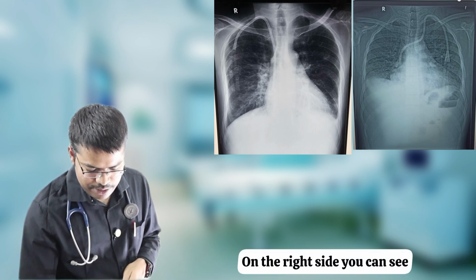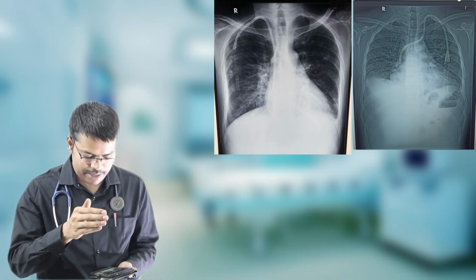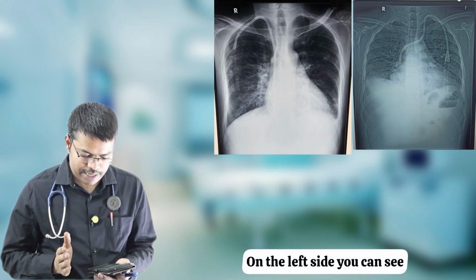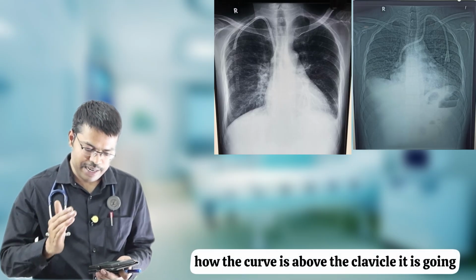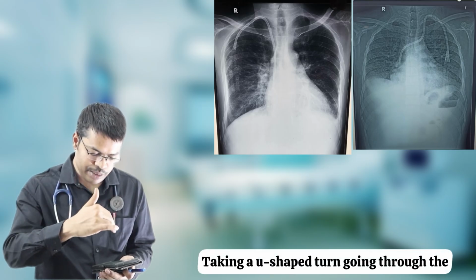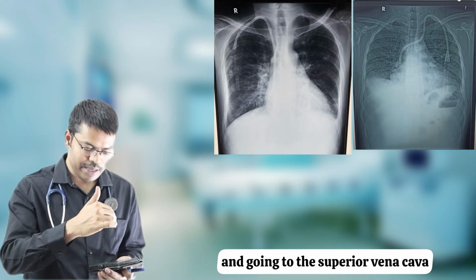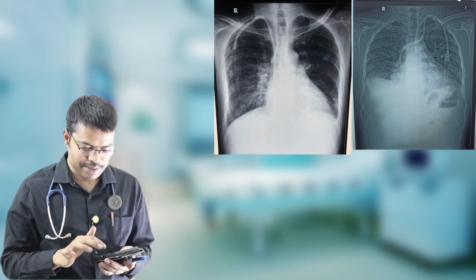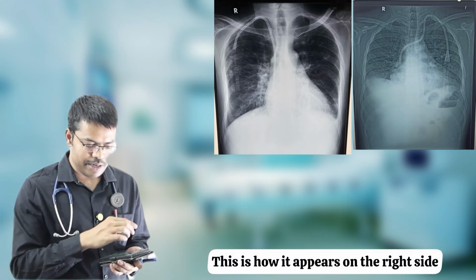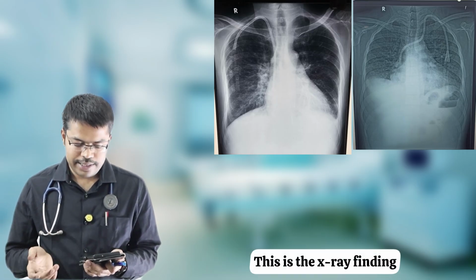On the right side, you can see the catheter is U-shaped and coming towards the right atrium. On the left side, you can see how the curve is above the clavicle, taking a U-shaped turn, going through the internal jugular, brachiocephalic and going to the superior vena cava and to the right side of the heart. This is how it appears on the left side. This is how it appears on the right side internal jugular vein. This is the X-ray finding.